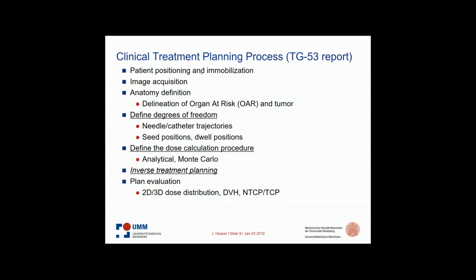Once you have inserted the catheters, you make a second CT, and then you see the catheters, so you do not need to position or immobilize the patient because the catheters are the reference. Once you see the catheters in the CT, you're done. For LDR, for example prostate, you have direct live ultrasound, and the imaging is directly related to the patient. So the immobilization is essentially just fixing the grid and the ultrasound to the patient, which is just the positioning.